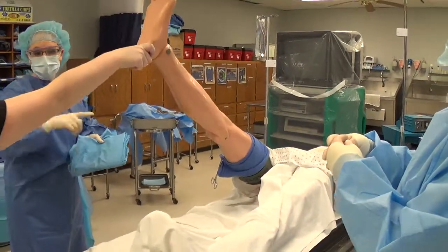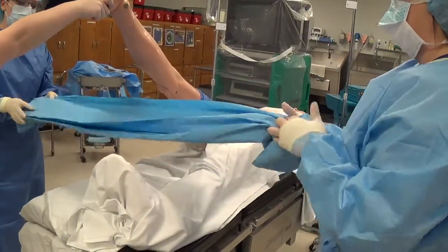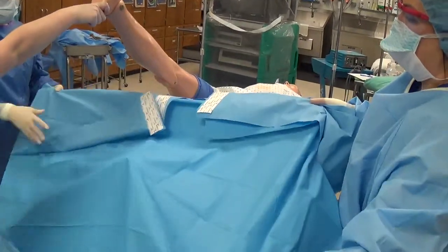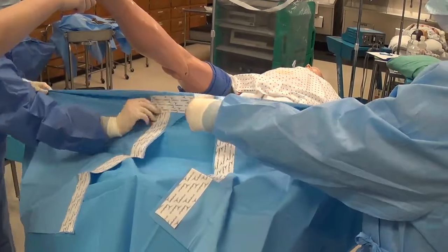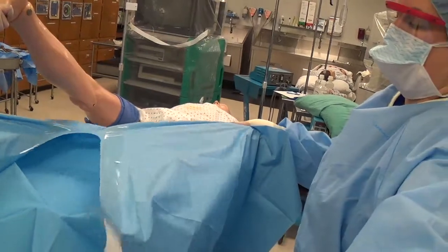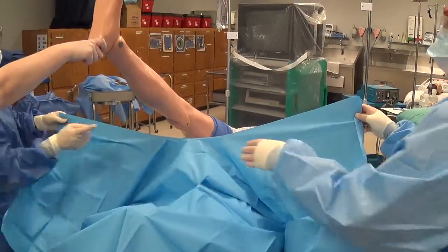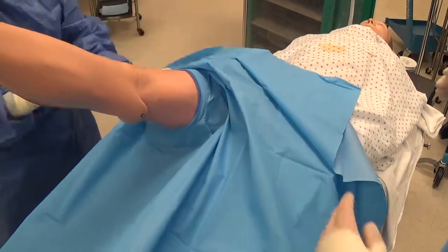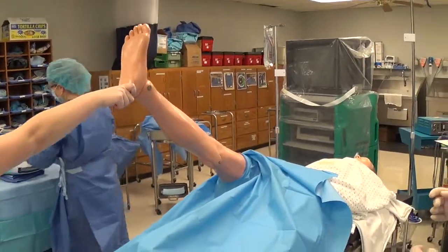Your unsterile person is going to give you as much space as they possibly can. You're going to open this up and hand it to the other sterile person that you're draping with. Grab the top layer, cup your hand, extend out over the foot of the bed, hold tension up here, pull the tails back, and pull the paper off always from the top down. Then grab the top of the tail, switch hands, grab on the inside of the drape making sure that we occlude off that towel, and bring down one tail and then the other so that forms that circular type of fenestration.